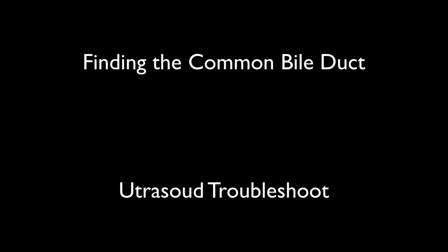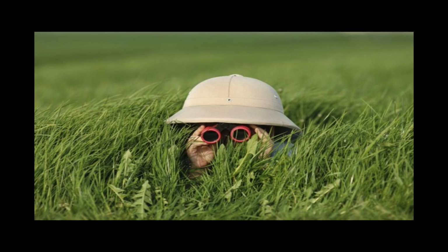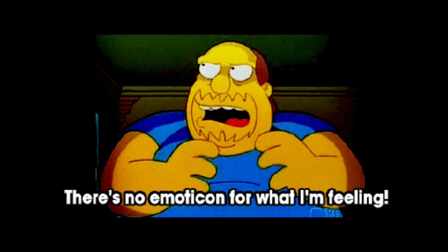Whether you are a novice or a resident trained sonographer, identifying the common bile duct can be a challenge. It can be extremely frustrating when you're first starting out, but there are some key strategies to use that will really help you on your way.